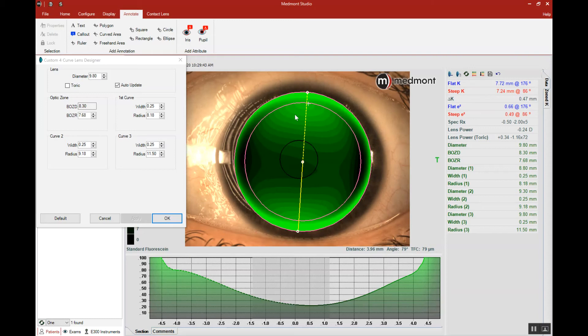Therefore, with this very toric cornea, we're going to need a steep meridian radius that's different from the flat meridian radius.